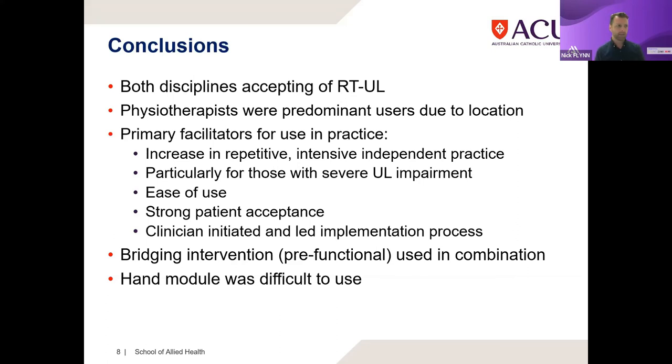And I think particularly when you're talking about those with underlying cognitive and perceptual deficits, simplicity in the diagram, the images they're seeing and interacting with, is quite helpful at times. Making it too busy or complex can be a bit of a deterrent.